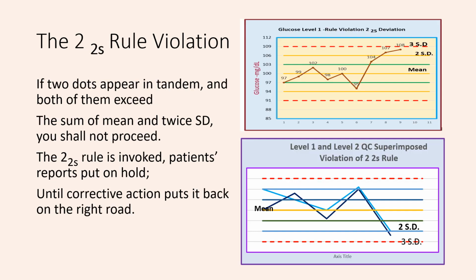If two dots appear in tandem and both of them exceed the sum of mean and twice SD, you shall not proceed. The 2-2S rule is invoked. Patient's reports put on hold until corrective action puts it back on the right road.